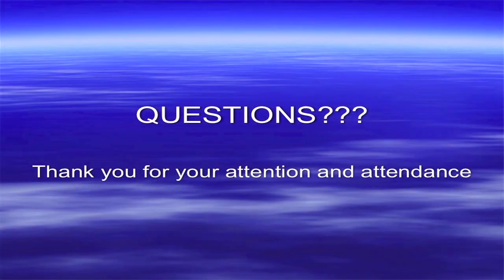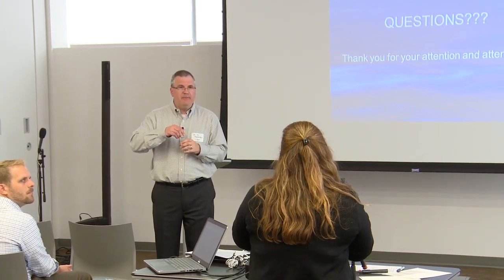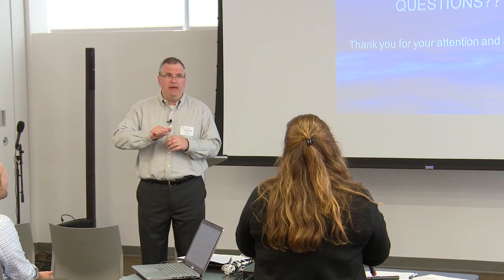Okay, questions? Yes, ma'am. So my question is about sonography. Are the requirements for reporting for mammography going to change so that they match for breast sonography? So having a BI-RADS, a finding, a recommendation? Yes, they should. They should already.